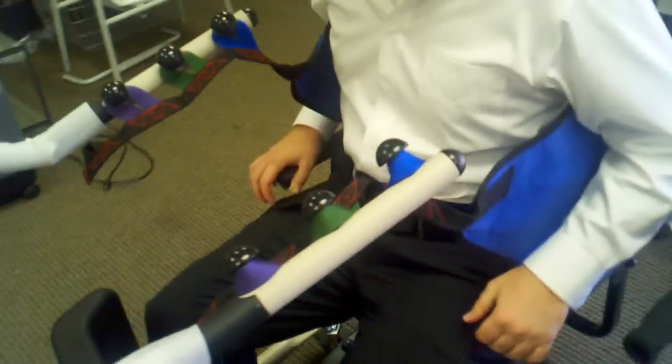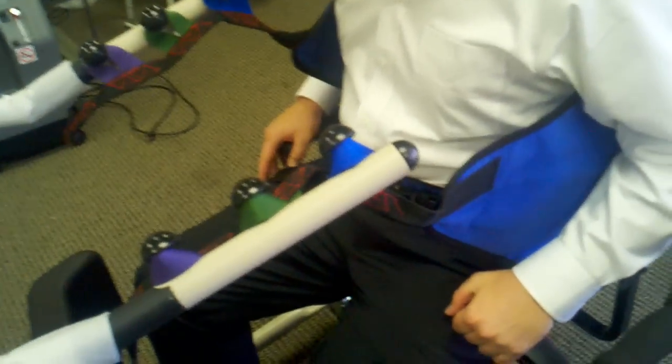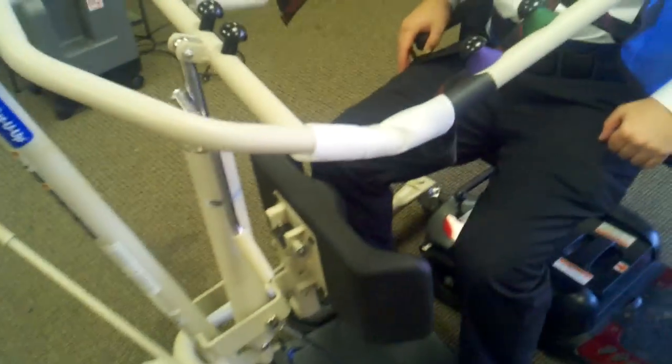The difference between a stand-up lift and a regular patient lift is this piece here. This is going to be underneath your butt — it goes from your back all the way to right about here. That way we can pick you up and you're going to be totally off the ground, and then we'll move you to the facilities, a lift chair, or anywhere in the house. That's the whole purpose of this.